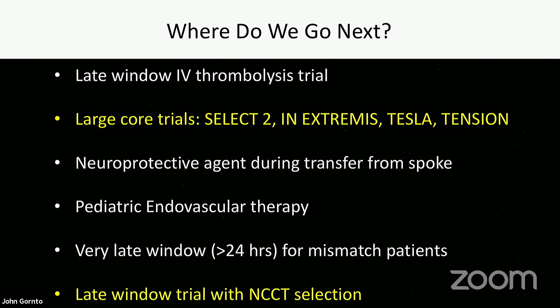I've also highlighted down there late window trials with non-contrast CT selection only. The big one going on now is MR CLEAN LATE. It's looking at just non-contrast CT, but it's looking at collaterals based on CT angiography because they are concerned that if you've got terrible collaterals in the late time window, that's somebody who may not benefit.